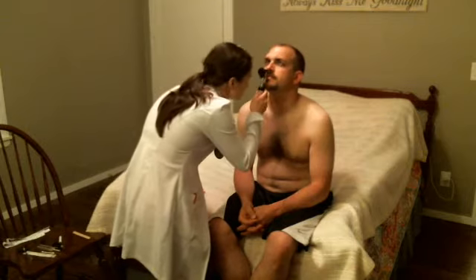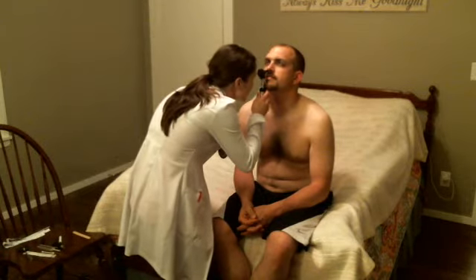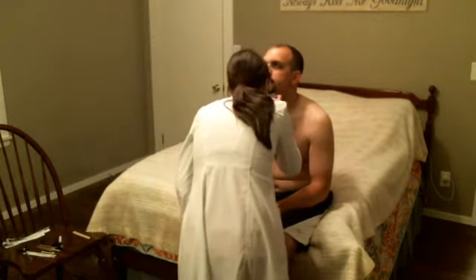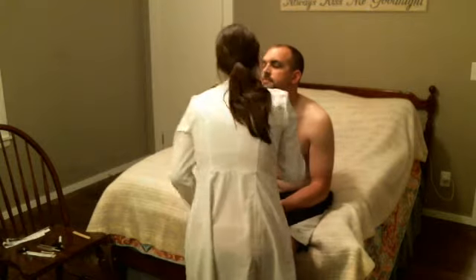Using my otoscope, I'm then going to check up his nostrils, checking his turbinates, his septum, and his mucosa. Noting his mucosa, ensuring that it is nice and pink. His turbinates are nice and pink. There is no swelling in his septum. There are no perforations, and there is no redness. Good. Thank you.